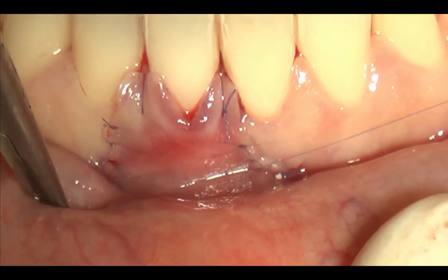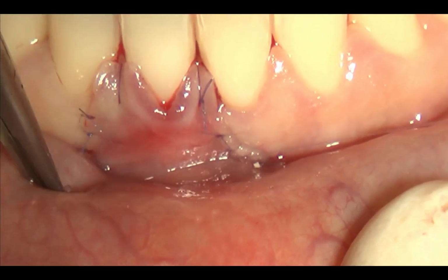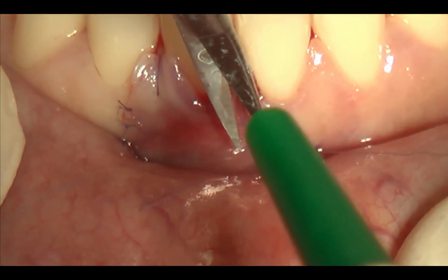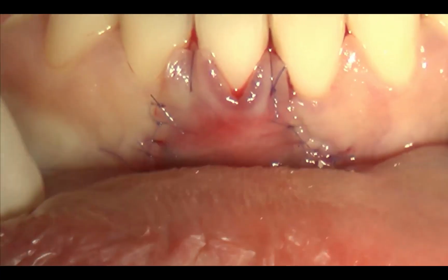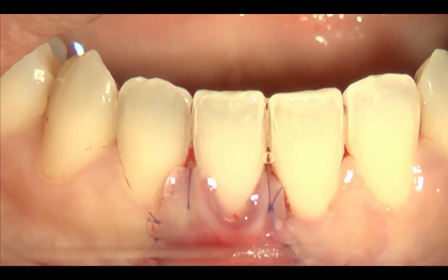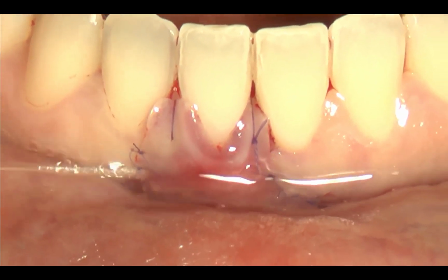Very calm. Physiological. Now you can see that the vestibulum depth is completely replaced.